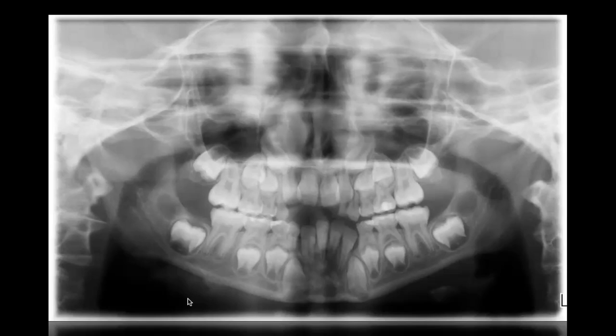What evidence can you start to point to that would indicate that maybe they're not palatal or facial, that you can see potentially on this panel? Okay, so which lateral? It looks like there is resorption happening possibly on this lateral. Now, it's a 2D image, it's hard to see. We can see that the root formation is not complete, so is it resorbing? Is it incomplete root formation? But certainly if there is resorption there, that would tell you maybe it's right in the middle, okay?